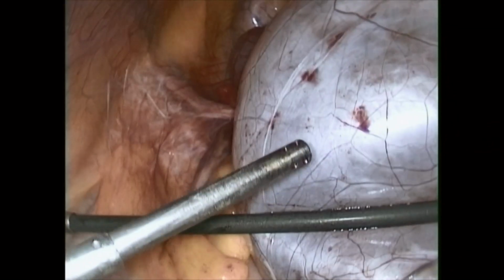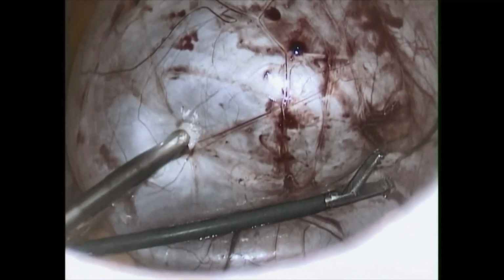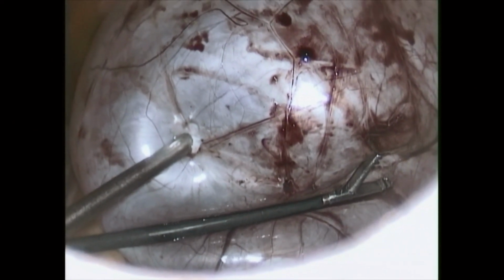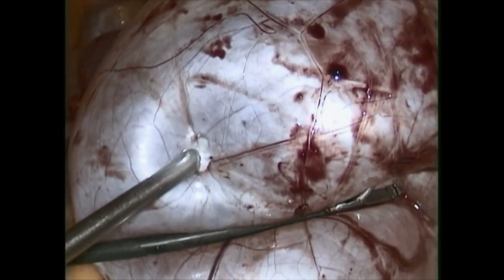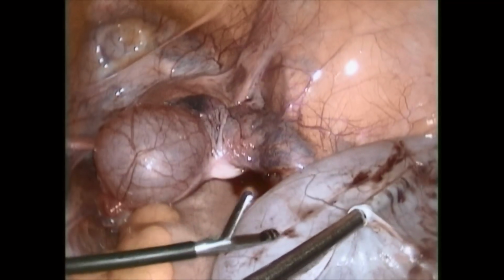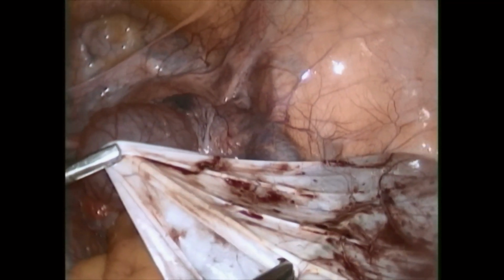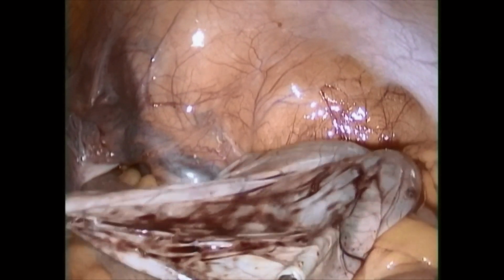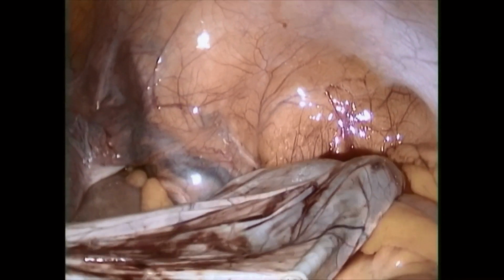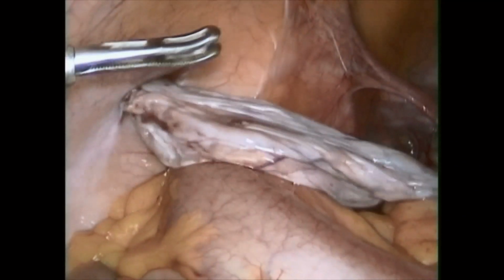There was another one here. Just aspirate the fluid and you can take the cyst wall out through the lateral 5 mm port. You can just widen the port site and pull it out, which I'll show you here. You need not put an endo bag in this case. Now it is being removed.